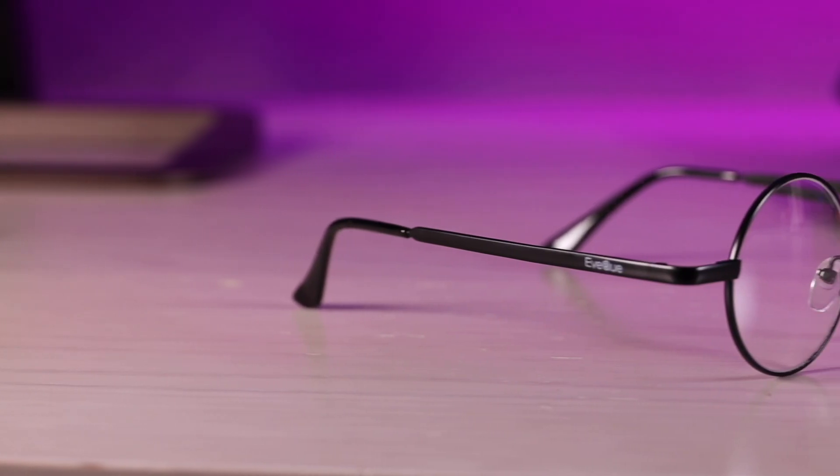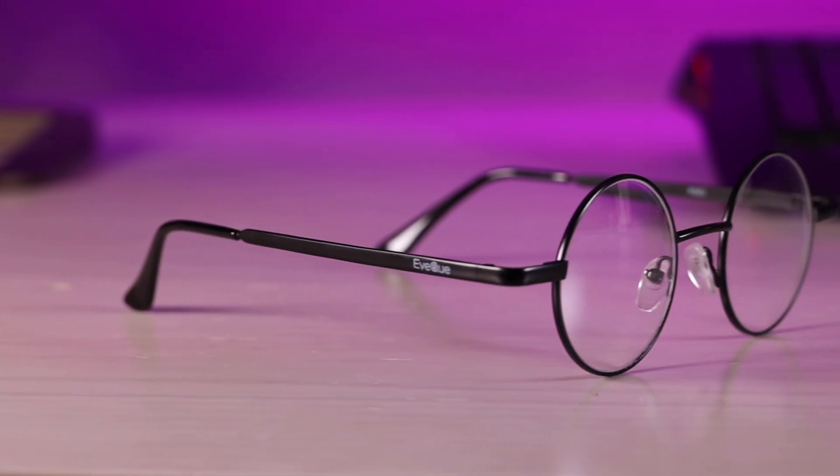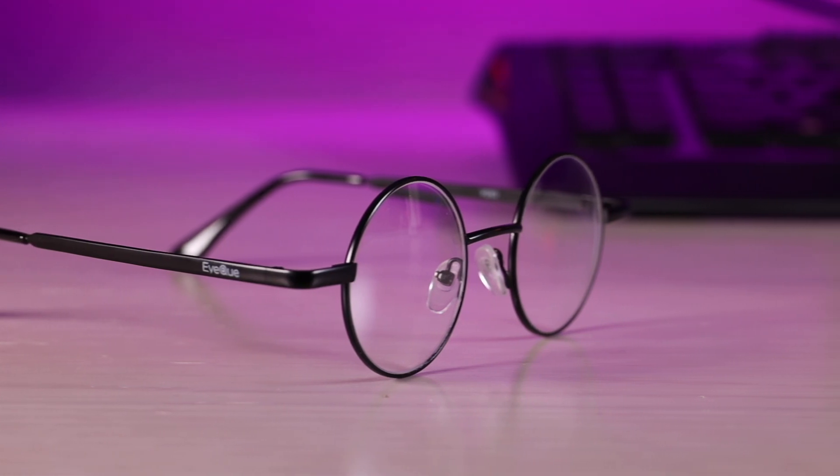I'm probably going to order some that look a little better. These are just specifically to show you what your vision would look like with the correct lenses. To me these give off a bit of a Harry Potter vibe, but for someone who's never worn a pair of glasses, I have to say this is amazing.